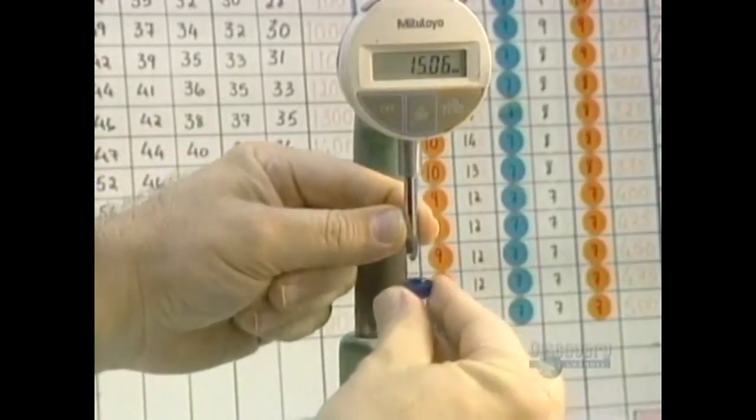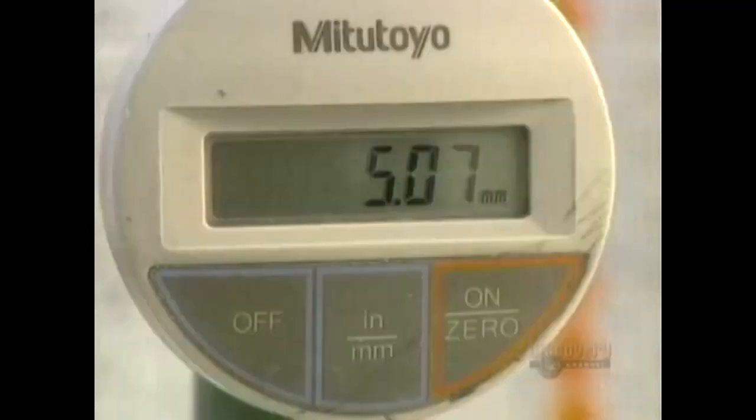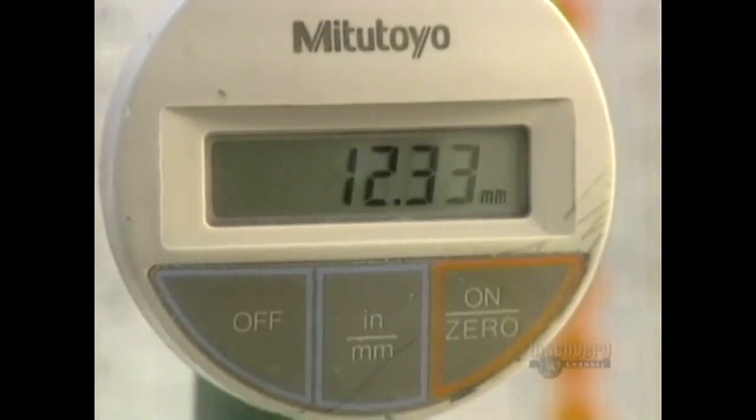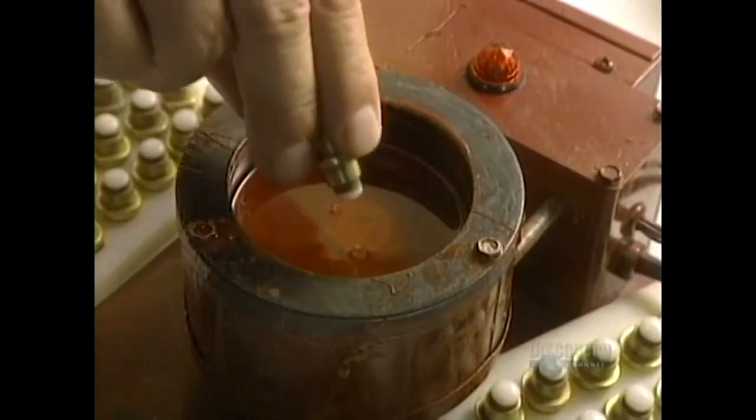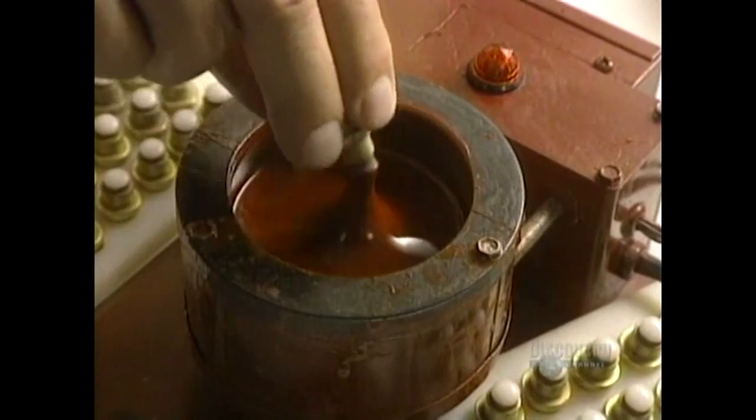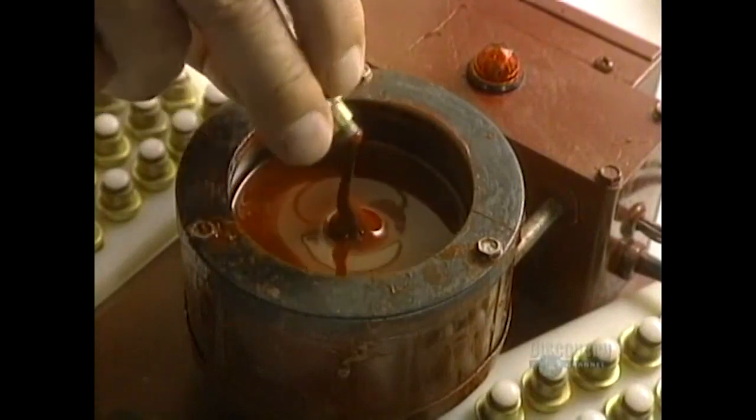A technician measures lens thickness with an extremely precise gauge. They now shape the outer surface, the part which touches the eyelid. The lens is glued with a special warm wax.